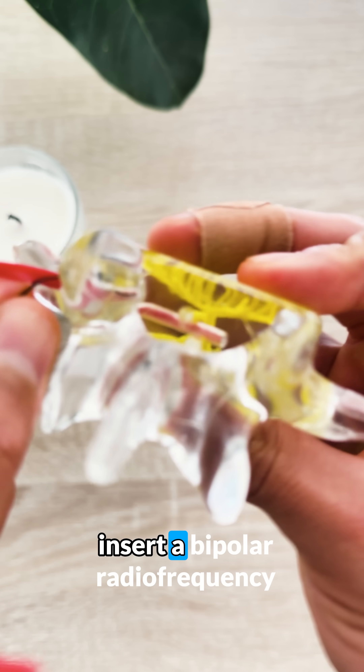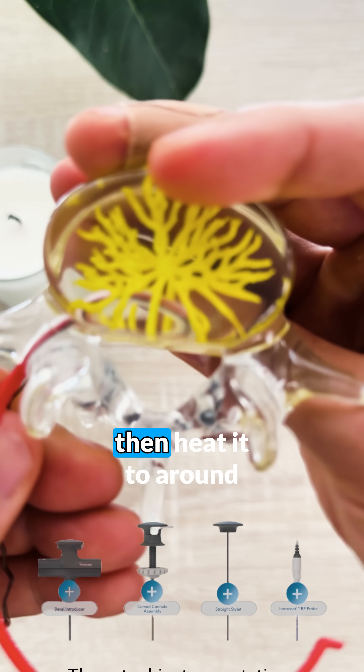We subsequently insert a bipolar radiofrequency probe through the cannula, then heat it to around 85 degrees Celsius for 7 to 15 minutes.